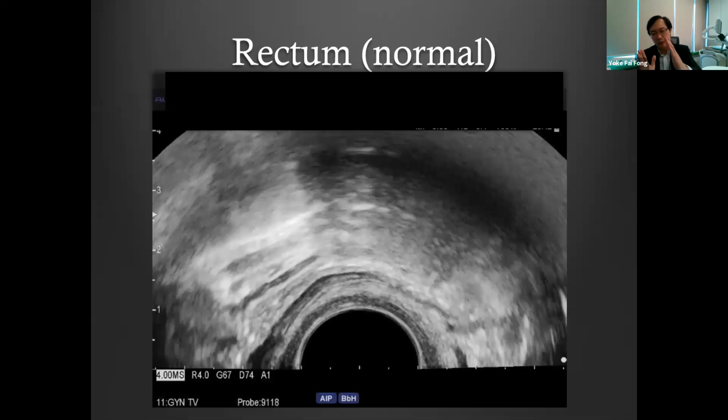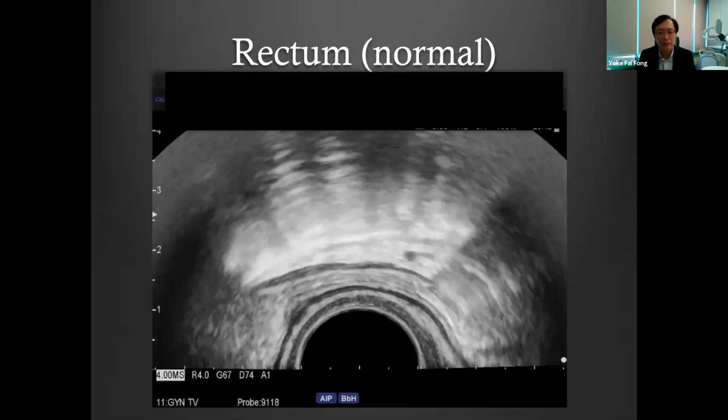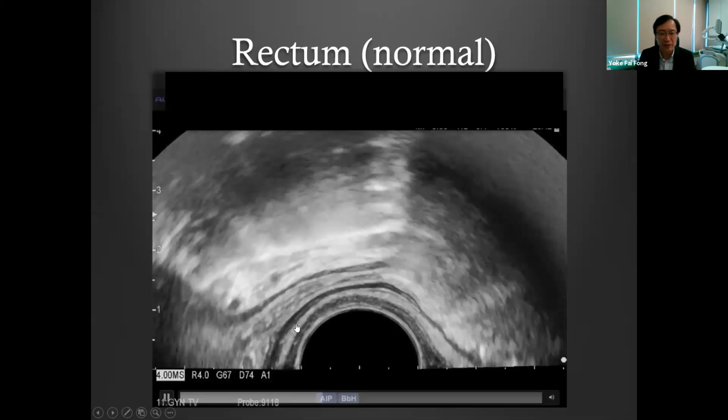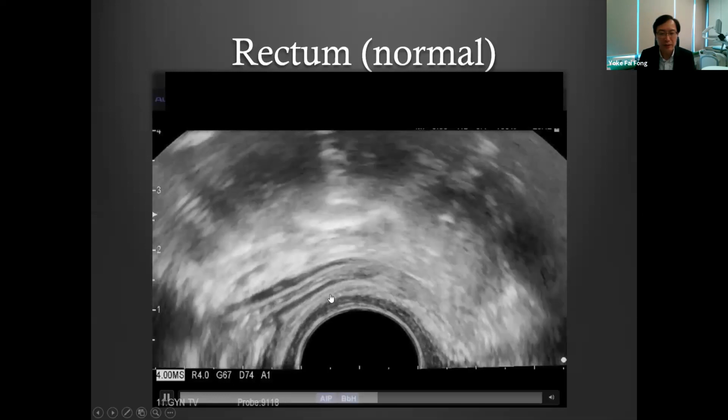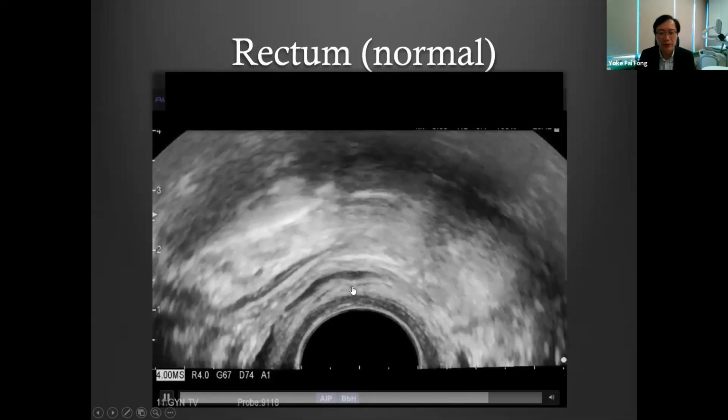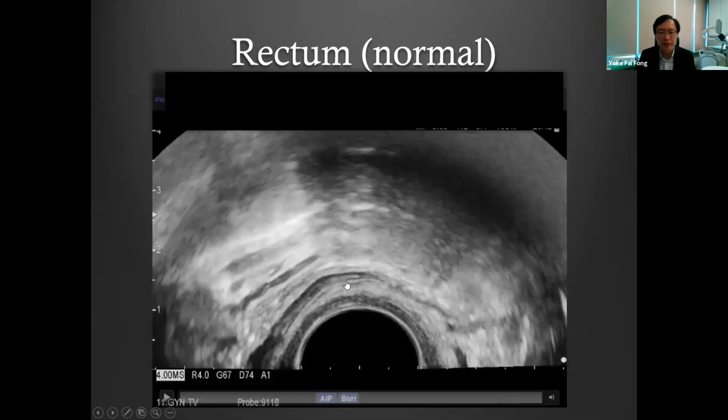And between the serosa and your probe, you can actually see that it's actually free and it's separate from each other over here. I'll show you again. Yeah, you can see here it's free. Okay. Up to here, I'm tracing up to here already, right? So I'll show you the next one.